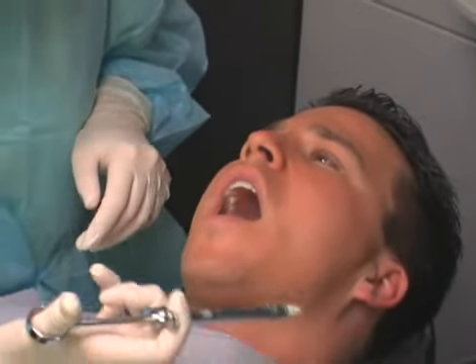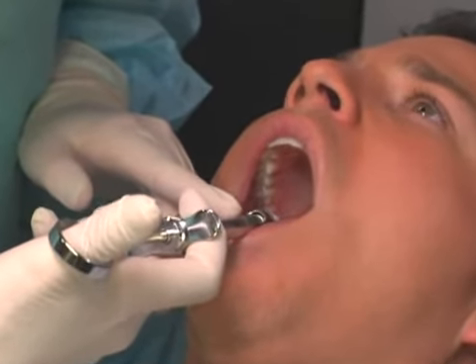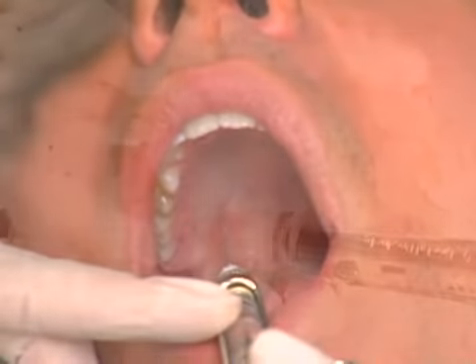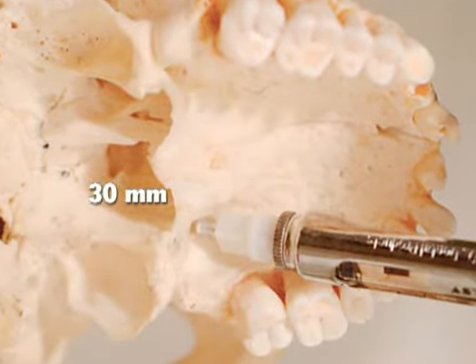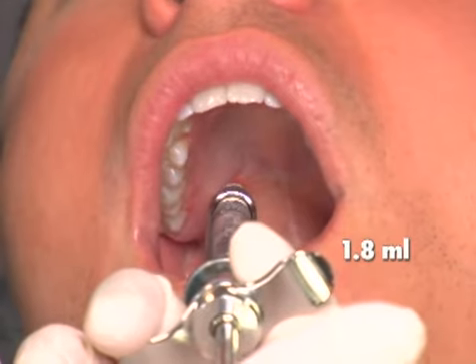Following completion of the greater palatine nerve block, the needle is inserted into the soft tissues over the greater palatine foramen. The needle is inserted into the greater palatine foramen and advanced to a depth of 30 millimeters. Following negative aspiration, 1.8 mL of local anesthetic is deposited slowly over minimally 1 minute.